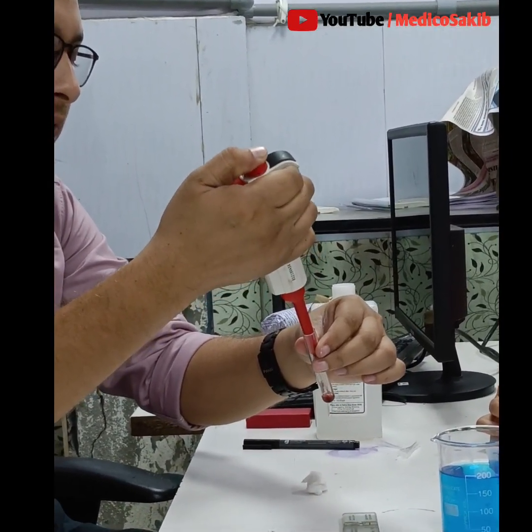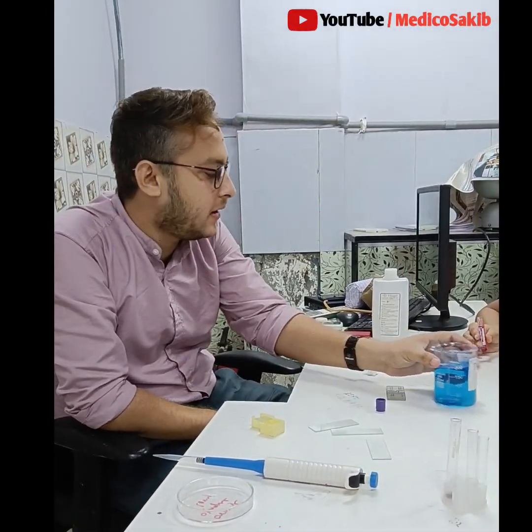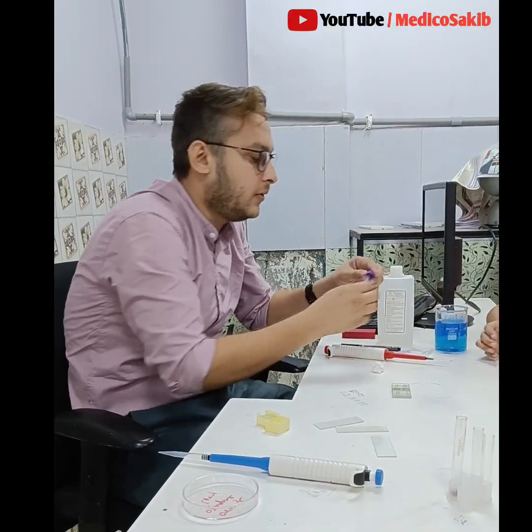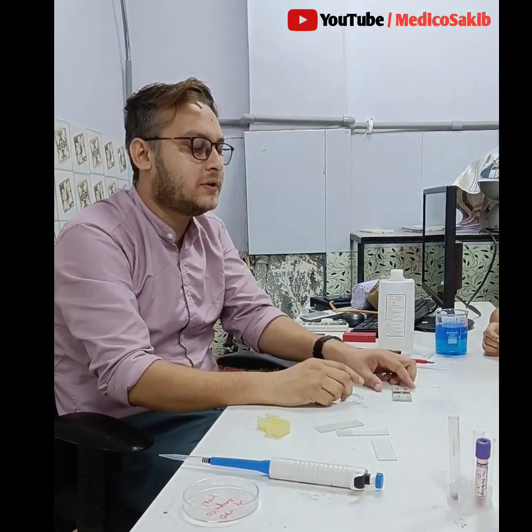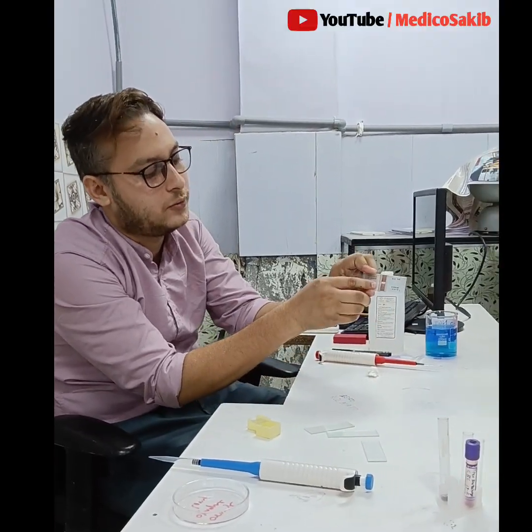But in this video we generally dilute in a test tube. So we take WBC diluting fluid, that is TURK fluid, 380 microliter, then add 20 microliter of the whole blood and mix well, then charge the improved Neubauer chamber.